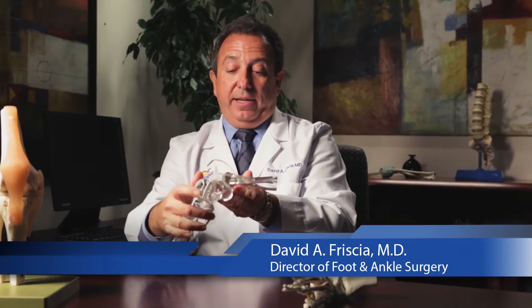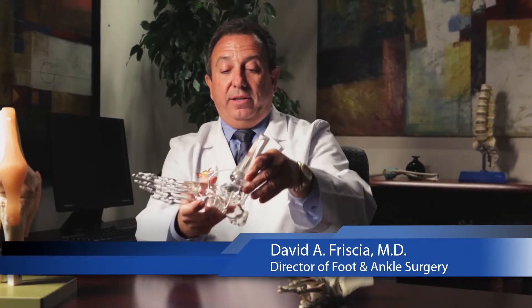This attaches to the foot into the tibia like this, and into the talus like this, and then that joint is replaced. The ankle replacements have been perfected and the instrumentation is much better. However, it's technically a very demanding operation, and you need to make sure the rest of the foot is aligned appropriately before considering patients for it.